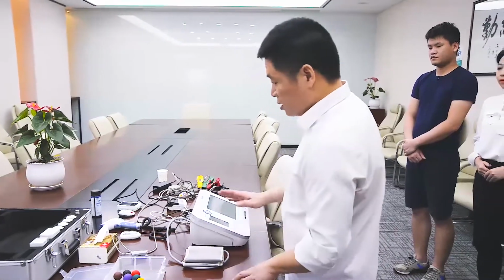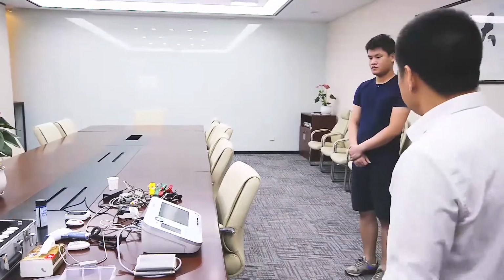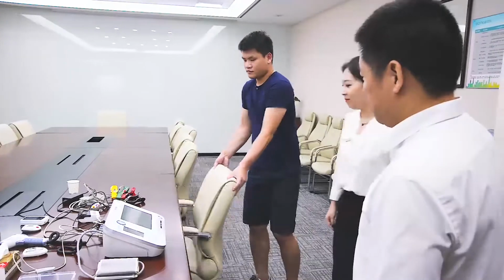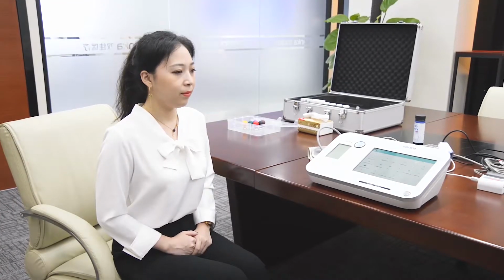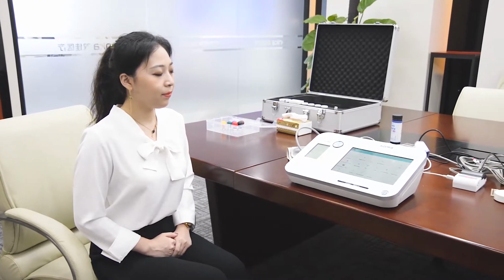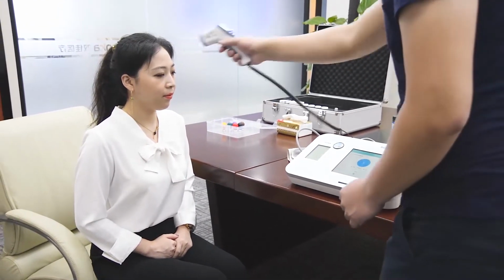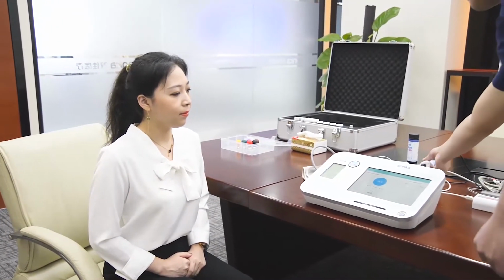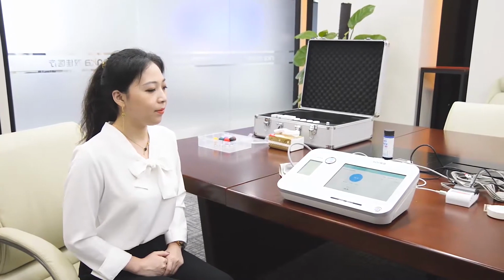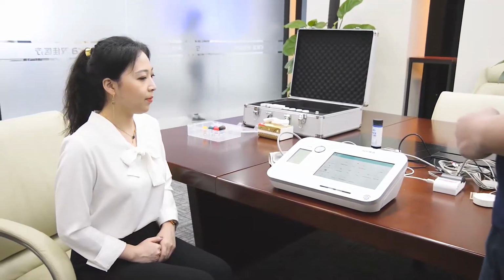Okay, now let's start the demonstration, please. Let's start from the body temperature. The temperature is taken. We're waiting for the result, about 5 seconds. Okay, we go to next item, please.